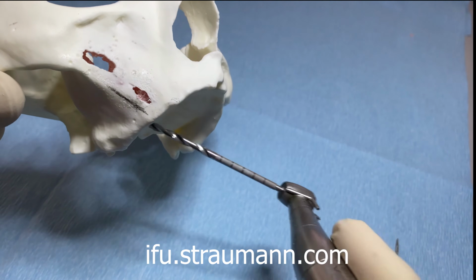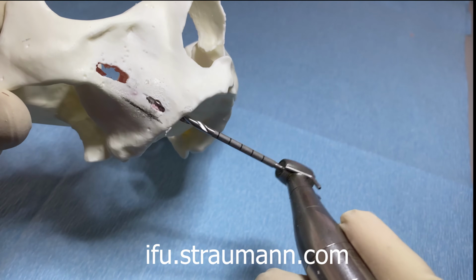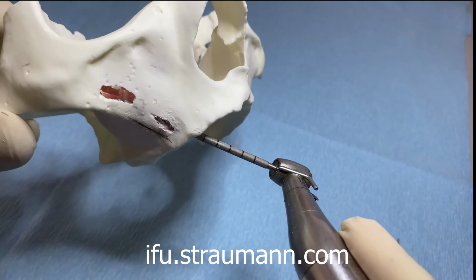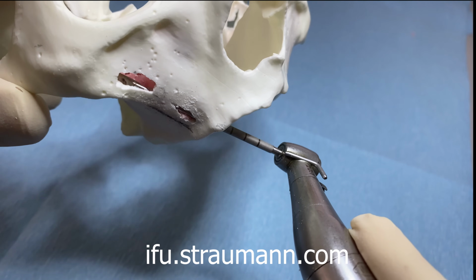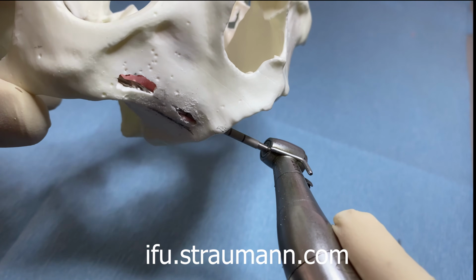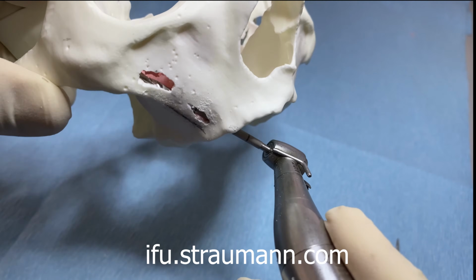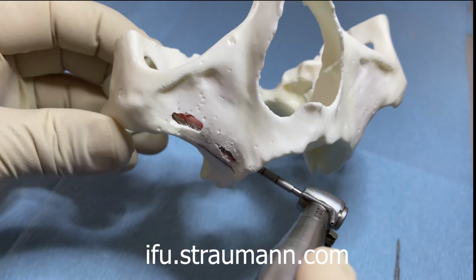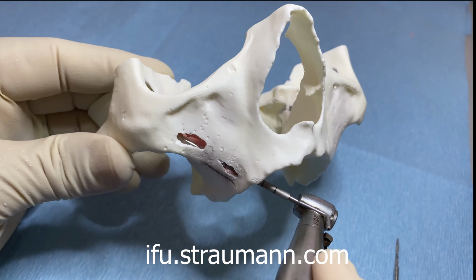Now I use my 2.9 millimeter drill, and I am again entering within the same. I'm looking at the shaft of my drill, making sure it is butt up against my lateral maxillary wall, and I gently go up, relatively slow RPM, until I am comfortable that I'm seated within the apex, in the round burr indentation that I had just made.